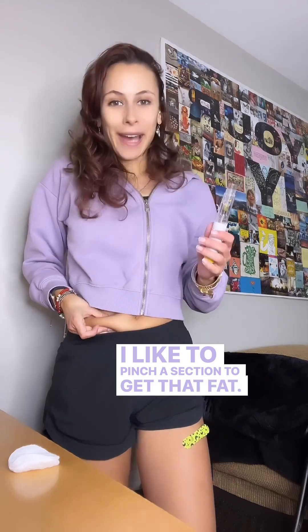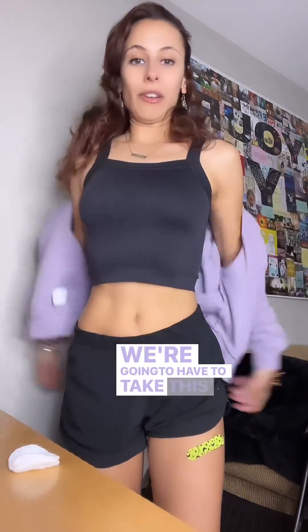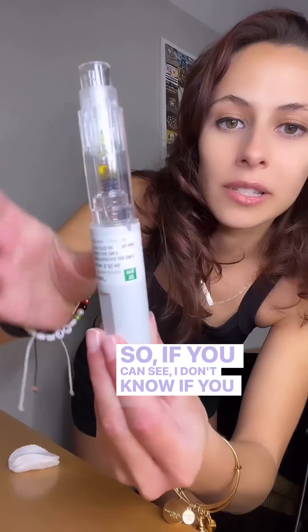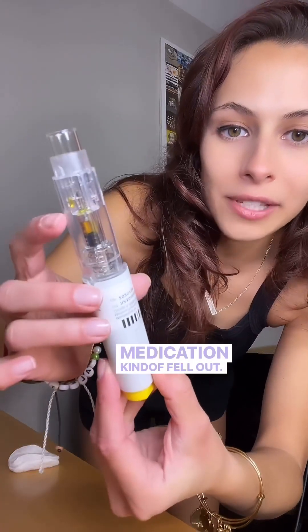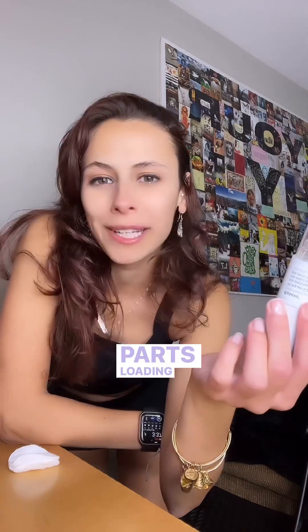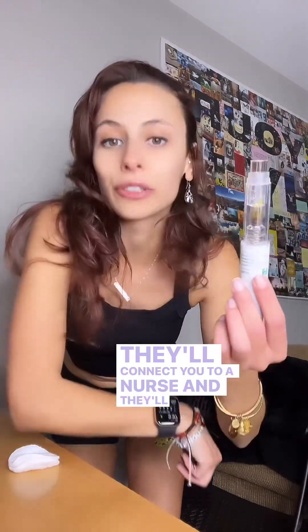I like to pinch a section to get that fat — it makes me feel better, but you don't have to do that with every pen. Medication kind of fell out — see, even though I did it upside down. So completely normal. You also want to look at the medication to make sure you don't see any particles floating in it. If you're ever nervous, call your pharmacy — they'll connect you to a nurse and they'll talk you through it.